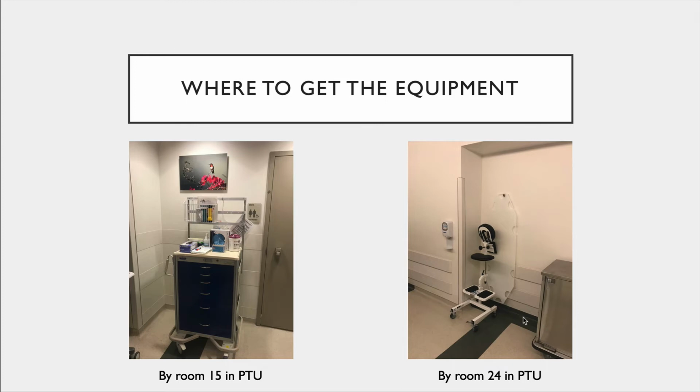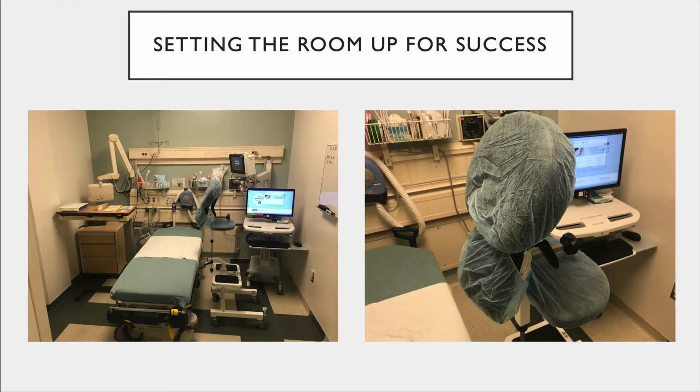You also want to grab this, what appears to be like a massage chair, in room 20, or by room 24 in PTU. Once you have all these things, then you can go to the bedside and you're ready to roll. Okay, let's talk about setting the room up for success.